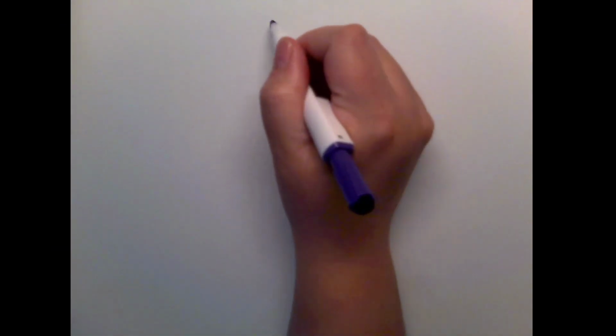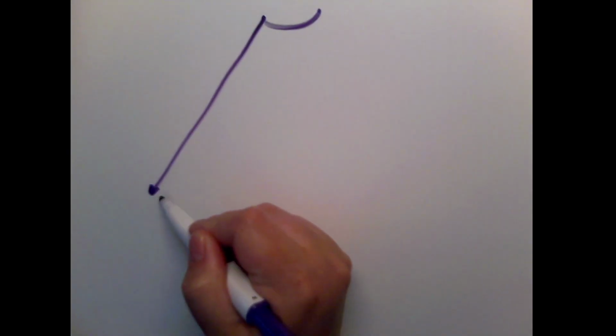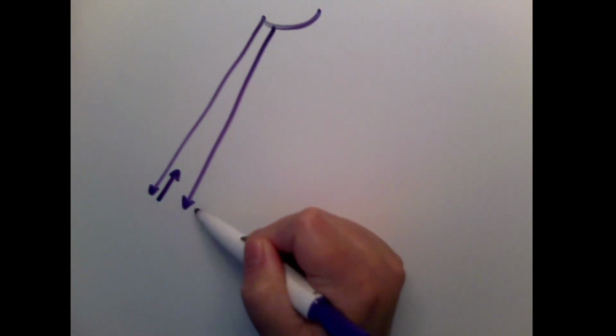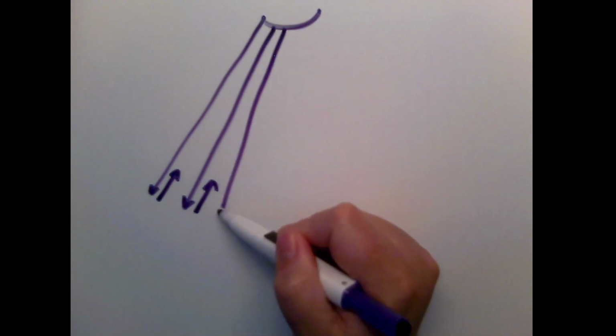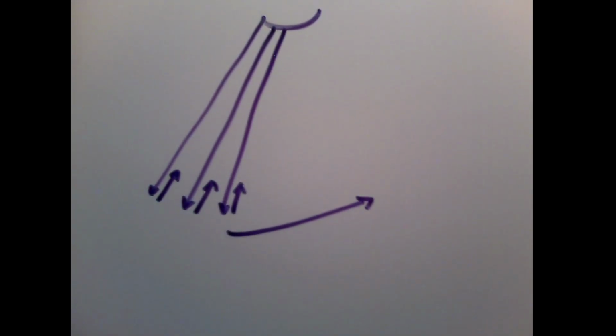Now I know that I have said this multiple times before. This is a chapter where all this really kind of comes to a head. Remember, we have our transducer. One beam is sent out. All of those echoes have to come back to the transducer before the next beam is sent out. All of those echoes have to come back to the transducer before the next pulse is sent out, and so on, as we move all the way across our field of view.